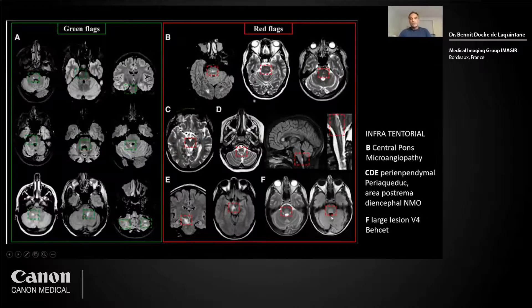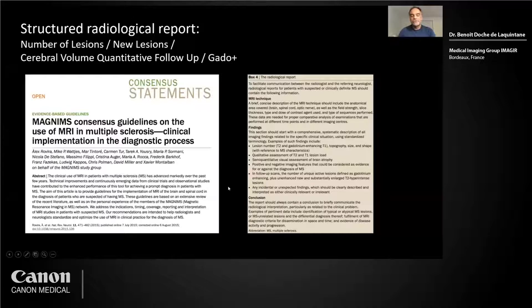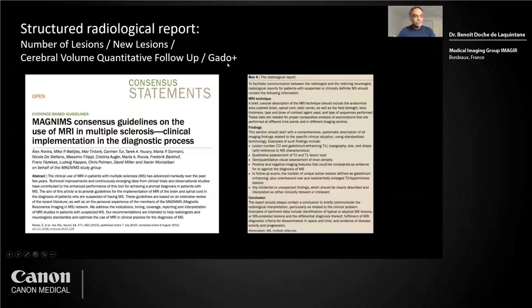To finish, the structured radiologic report: we need to be reliable for the neurologist, always reporting the same elements — the number of lesions, the new lesions, the overall volumes probably with quantitative follow-up, and the number of gadolinium-enhancing lesions. There is a consensus statement about what a radiologic report should contain, which is very interesting to read.